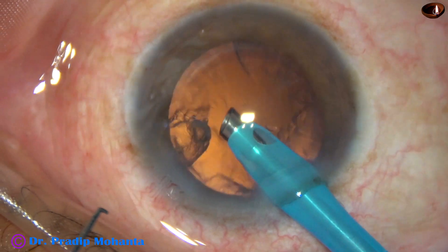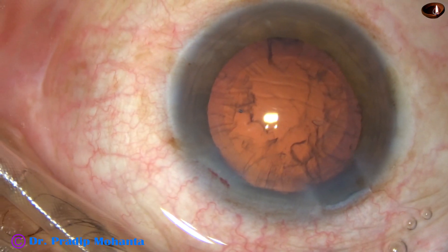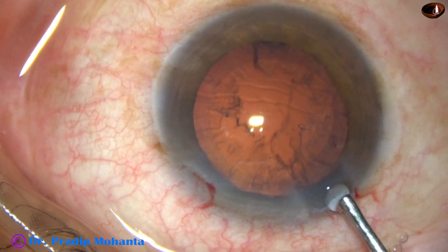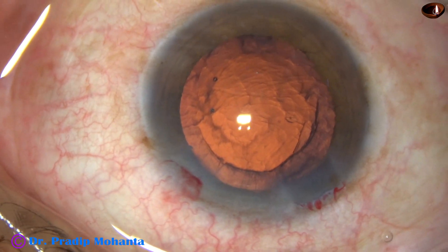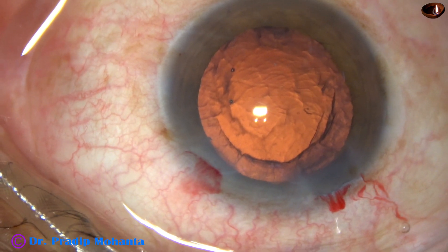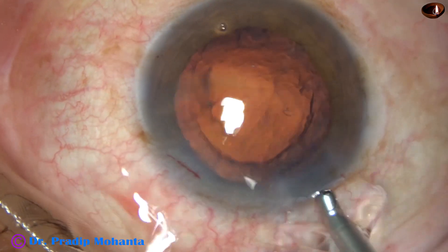And now, I take a utrata forceps, hold this capsular tag, lift the anterior leaf of the main incision, and go anti-clockwise all around, remaining at a certain distance away from the margin of the dilated pupil. And thus I get an adequate-sized, fairly round rhexis.